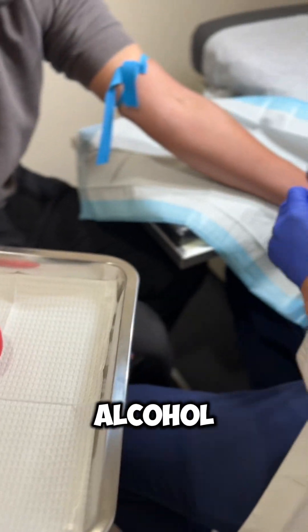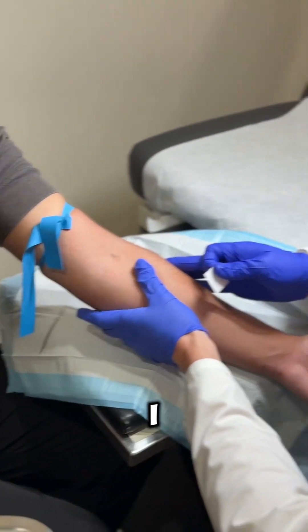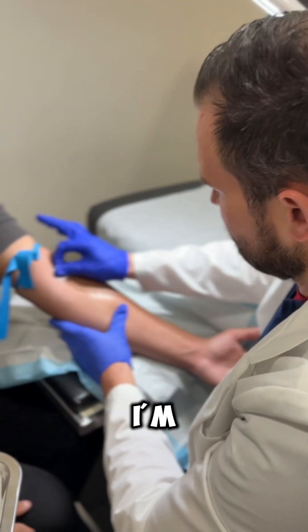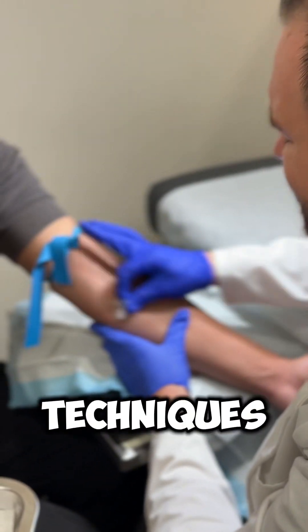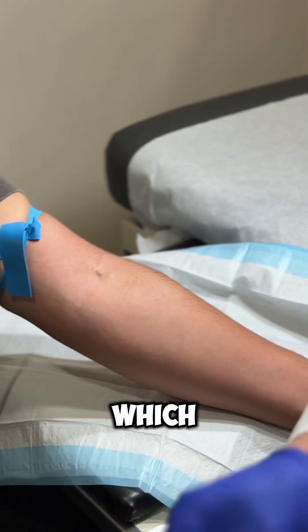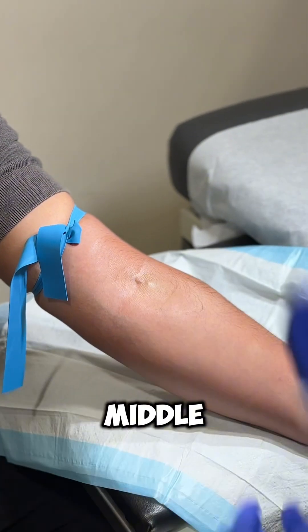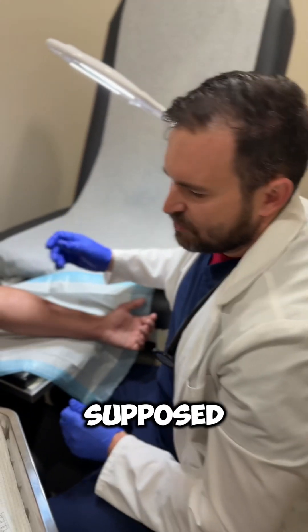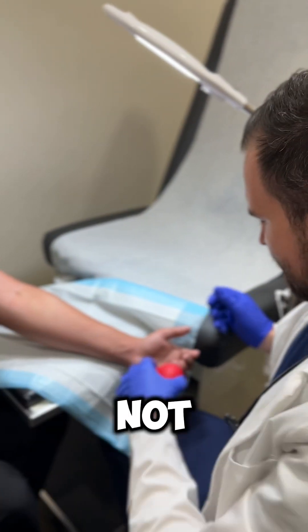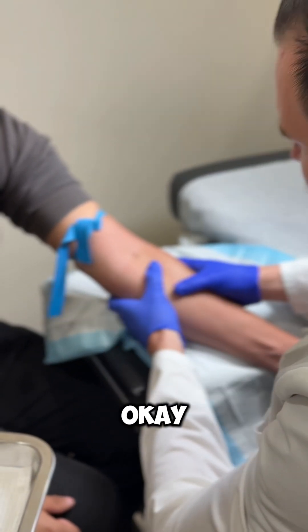The next step is to wipe with alcohol. I also like tapping the skin so I know where the vein is and it stays in the same spot. There are different techniques — some people wipe from the middle outward, or you can do a crisscross in the middle. You're not supposed to be cross-contaminating. You know the vein is approximate here, you've found the target, and if you're still not seeing the vein you can give it a little squeeze to fill it out.